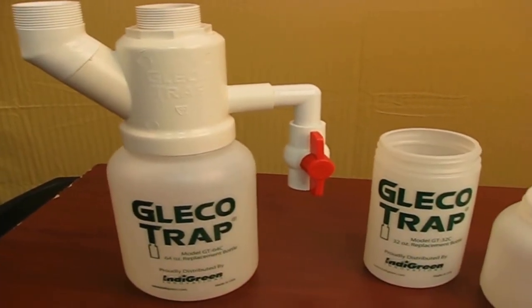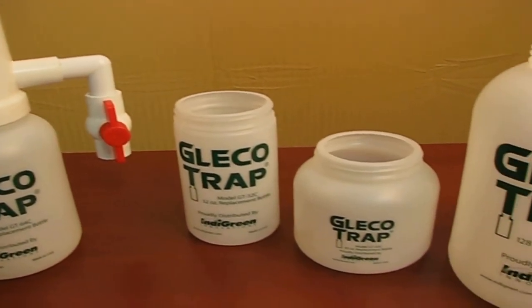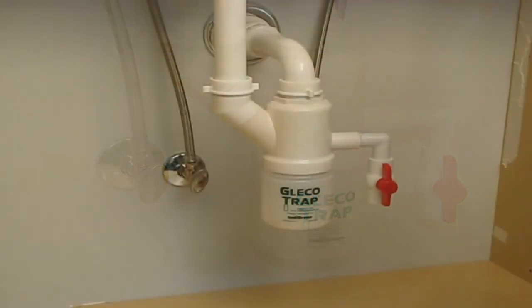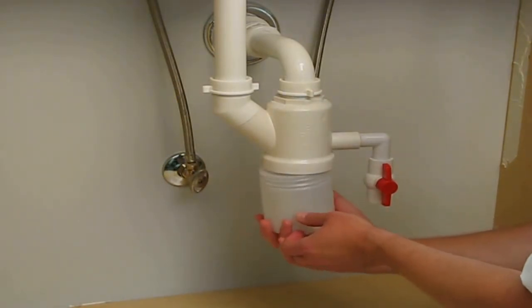Aside from the standard GT64, the Glico Trap comes in 32, 43, and 128oz sizes to accommodate a variety of cabinets. But wait — the Glico Trap is also a great way to retrieve lost items from under your operatory sink. Losing crowns, burrs, files, and other expensive items down your sink is a thing of the past.